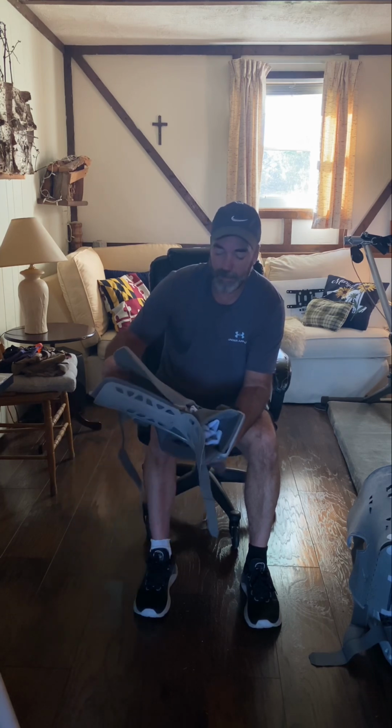At this point I'm in the boot with no wedges, so we're at 90 degrees. This is a very helpful and necessary device, but it doesn't allow your ankle to move left and right, forward and back. It doesn't allow the calf muscle to be engaged, and it contributes to atrophy, the wasting away of your muscle, your muscle turning into jello. It's alarming and concerning, and I'm sure you're like me, you don't want any parts of it.